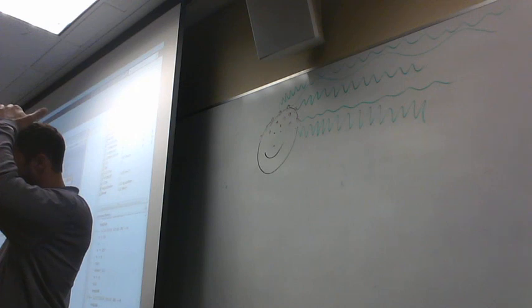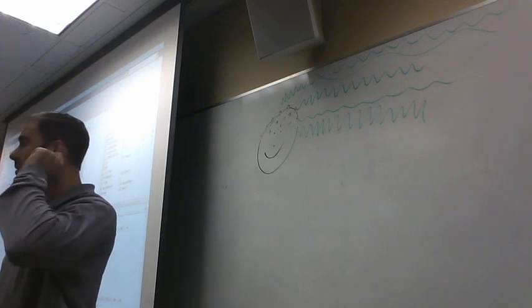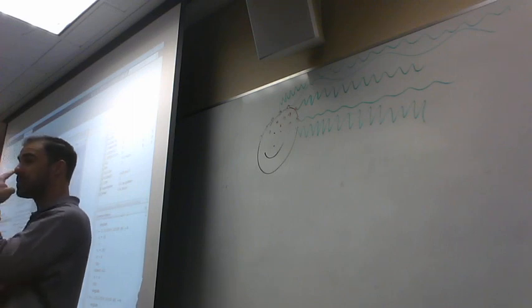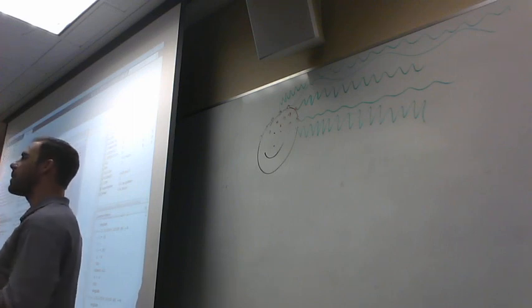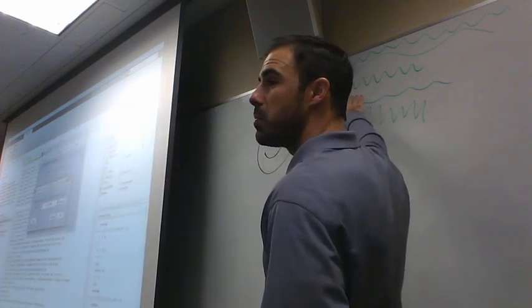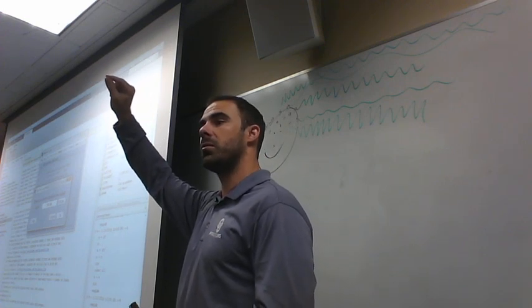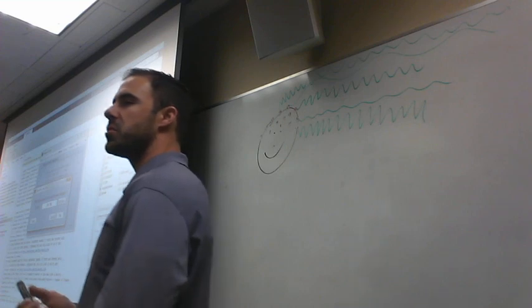You can use a central reference up at the vertex of the scalp. Sometimes people use the earlobe because it's obviously not going to have as much brain activity happening. You can record from there. Some people even use the tip of their nose. But everything that you look at here is just a measurement of electrical activity that's either up or down, and so when you measure it, it's always in comparison to something. What that means is that the value is going to change based on what reference site you use.